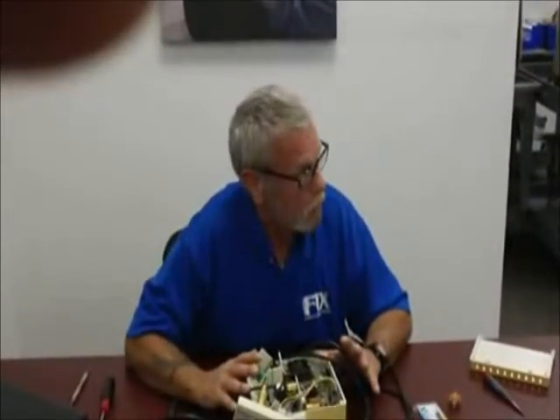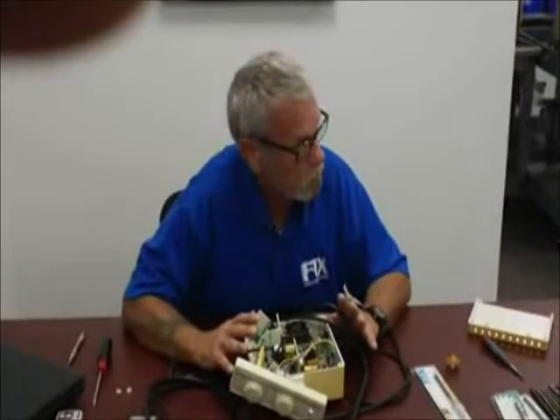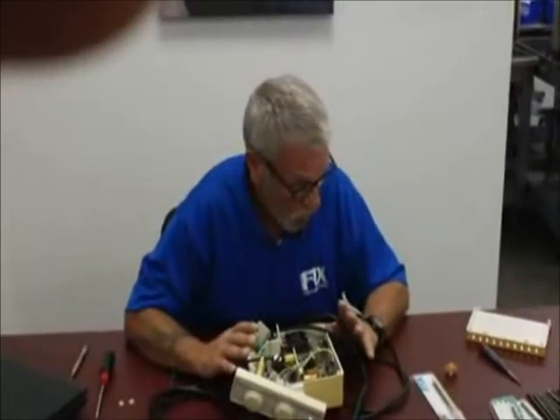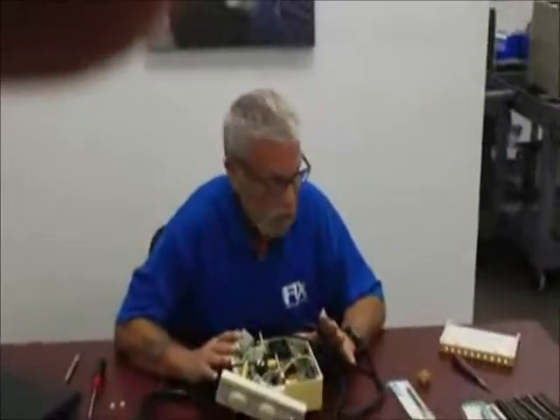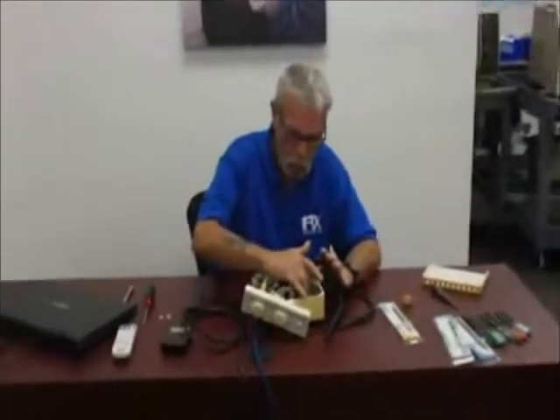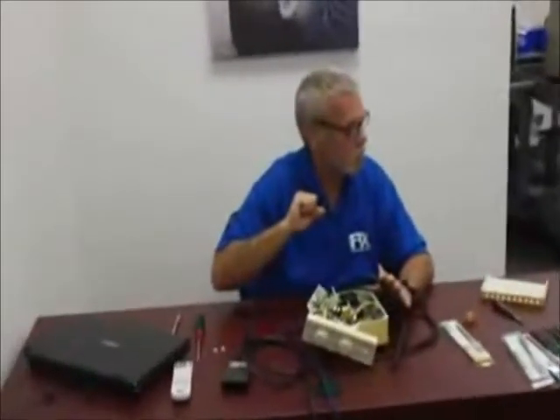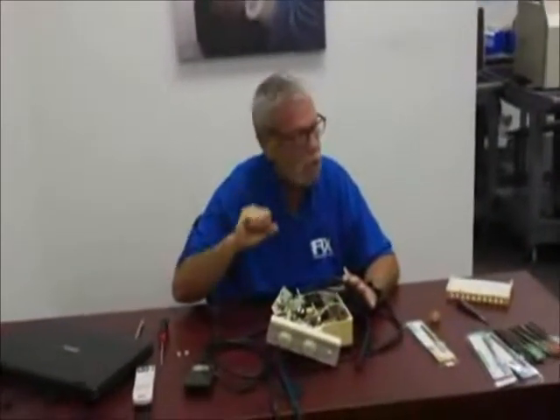This basically concludes the serviceability in the field. Ninety-five percent of your problems are field serviceable on the Cavitron — fully ninety-five percent. Again, if it's the power board or a circuit board, send it back. But everything else can be done in the field, and it makes you look like a hero.